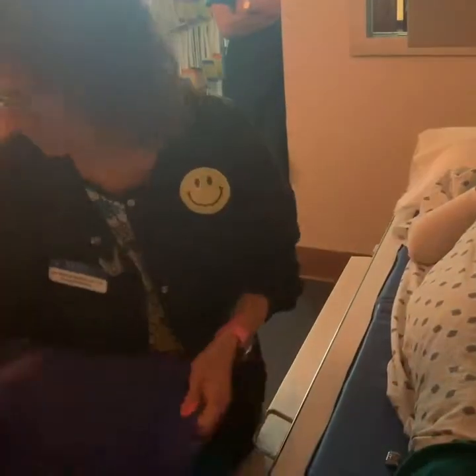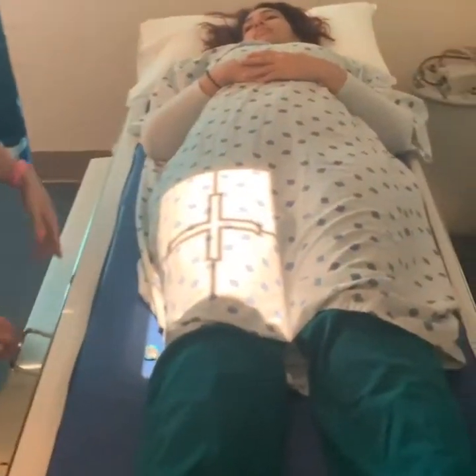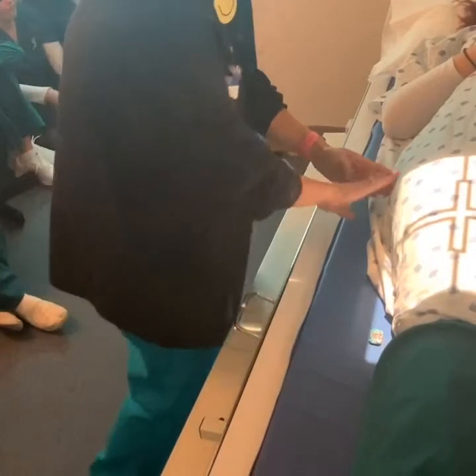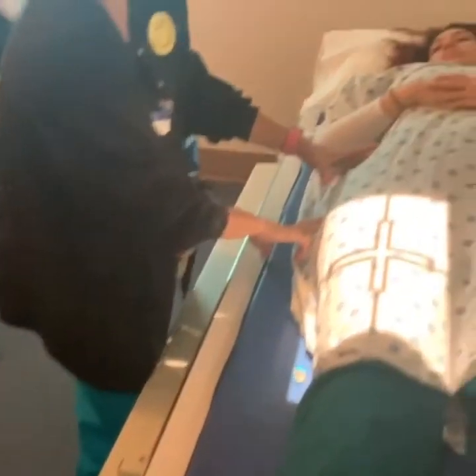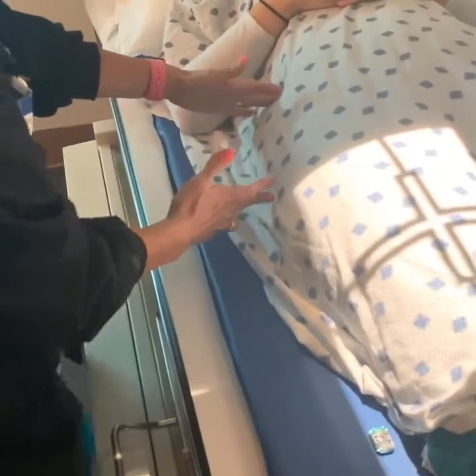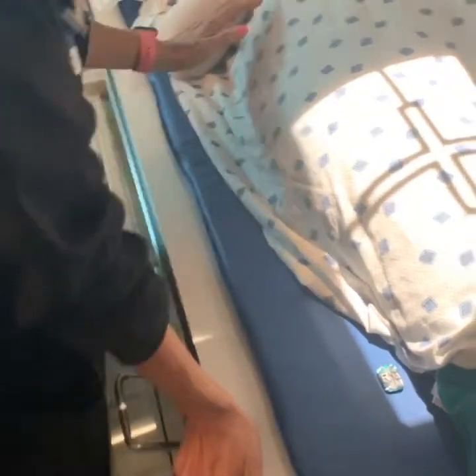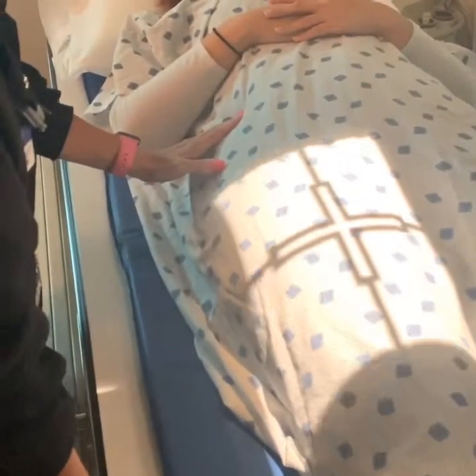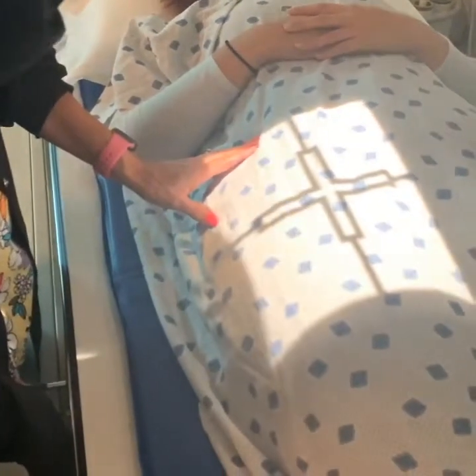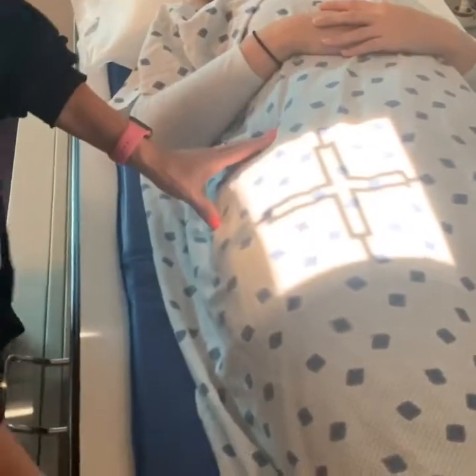We're gonna do proximal femur. So I'm gonna bring her down. Now, just so you guys know, you can see that the IR ends about here. I know with her iliac crest here, there's no way I'm not gonna overlap. Does that make sense? Because we said we tend to collimate. So like the IR ends here, her iliac crest is here. So I'm gonna move this. And I'm gonna collimate to 12 and 10 by 12 lengthwise.